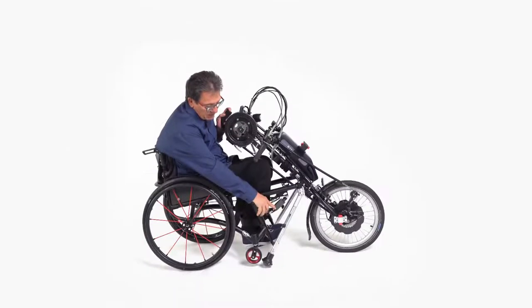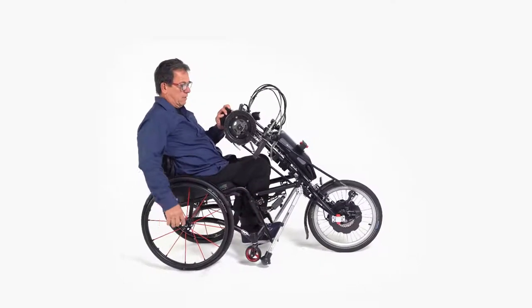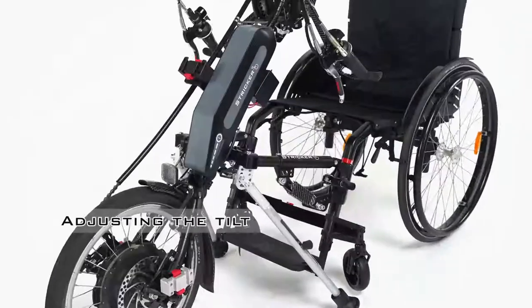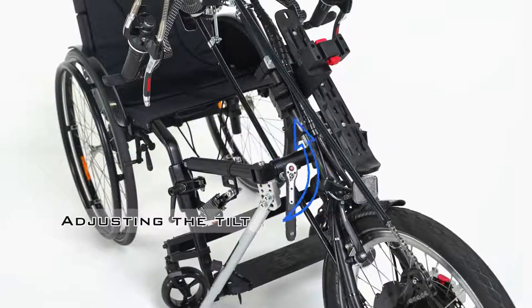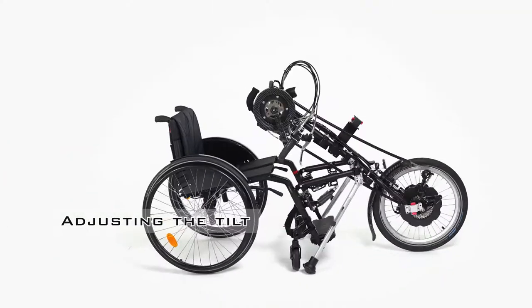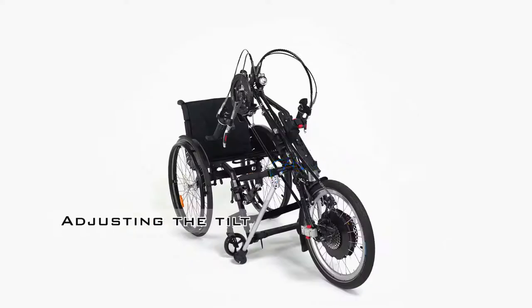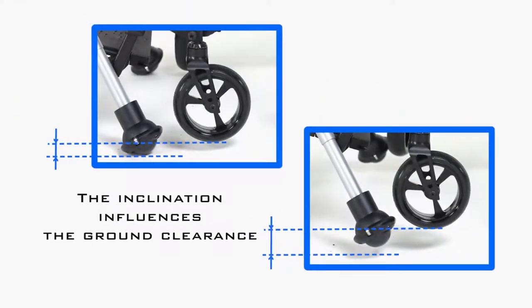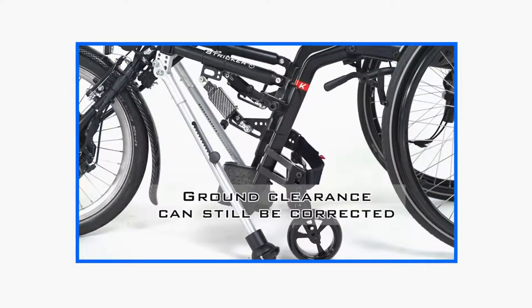To change the fork inclination, deactivate the automatic catch and lower the wheelchair wheels to the ground. Then loosen the two rear frame screws. Now change the inclination until you have found the right position, and finally tighten the screws again. Note that this adjustment affects the floor distance that was set by the automatic catch mechanism, which may have to be corrected afterward.